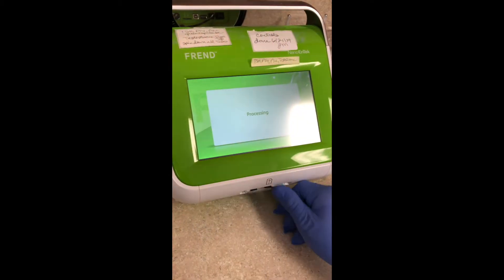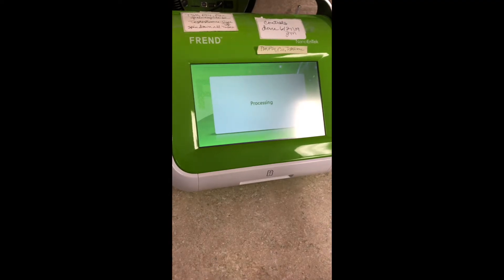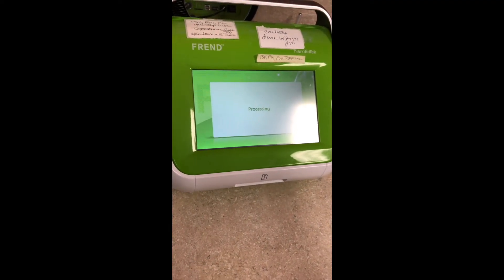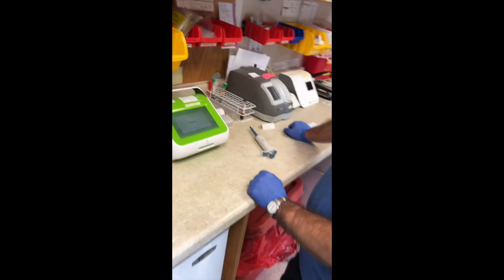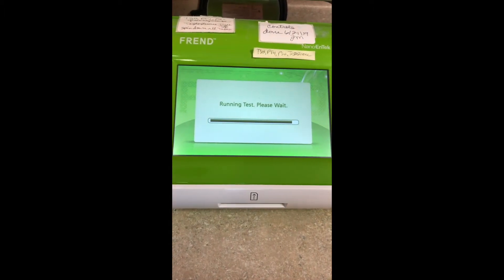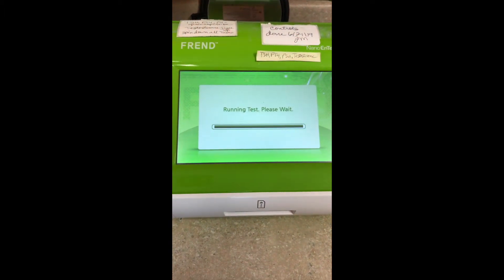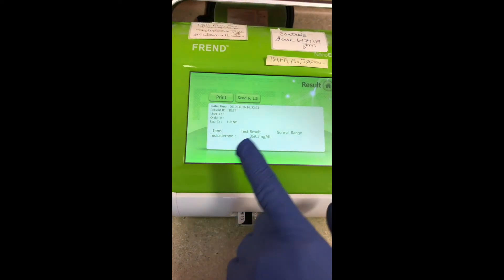It has already dropped the sample into the cassette. All you have to do now is enter your information and set it in. The testosterone only takes about a minute to run — it's really fast because it's been set in the machine and incubated. The longer you leave the serum in the cassette, the shorter the time in the machine. We have a result of 369, which is within normal limits.